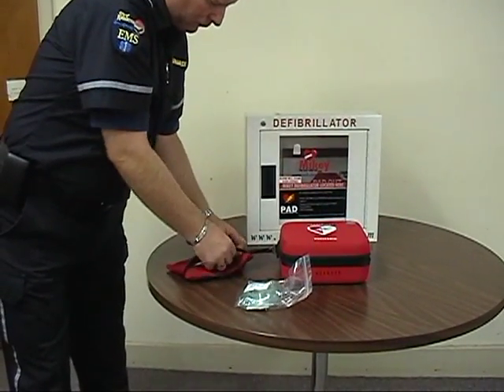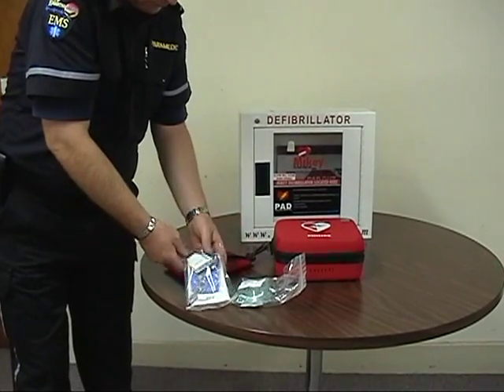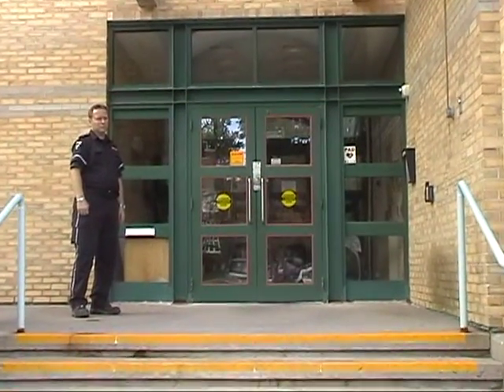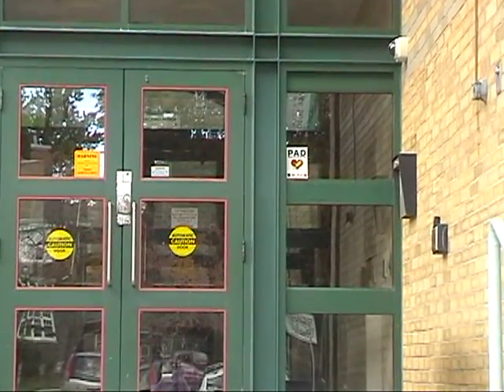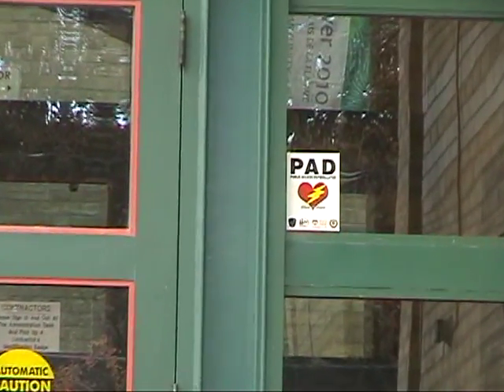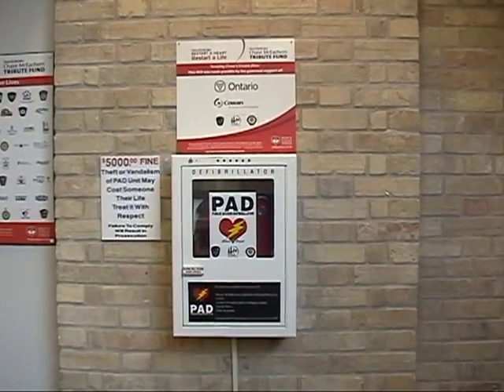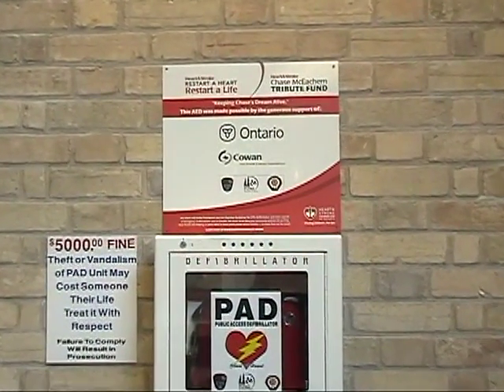Check the content of the fast response kit. It should contain a pocket mask, razors, gloves, and scissors. At this point, check your PAD site for signage. Simply check the main doors to ensure there are stickers identifying it as a PAD location. We should be looking for highly visible signs near the PAD device and also on washroom, lunch room, and other common area doors.